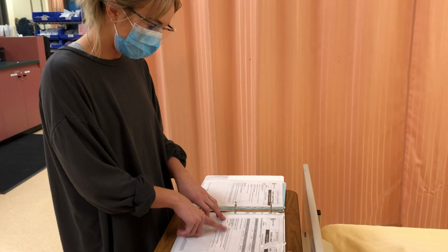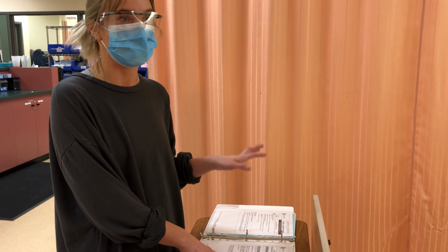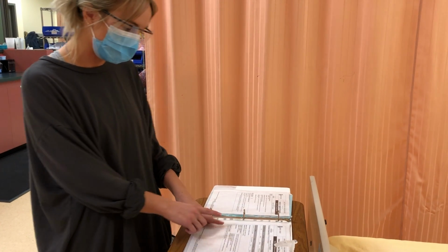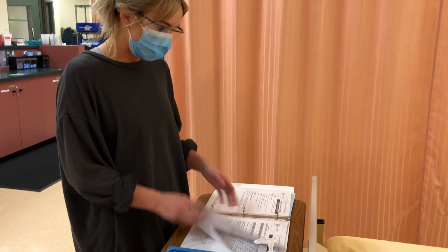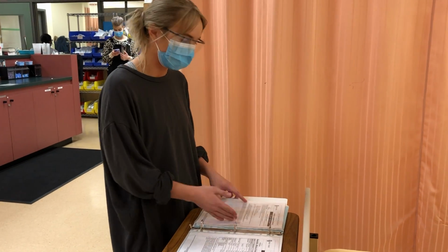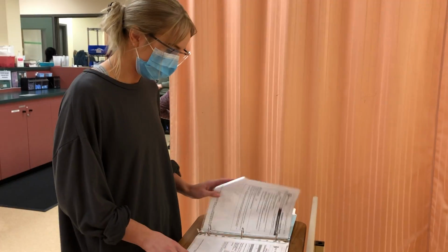For our stability and compatibility, it is compatible with normal saline, which is good because I know the patient has normal saline running TKO in their room, and we're going to be mixing it up with normal saline. Then some potential hazards: hypoglycemia, blurred vision, sweating, tremor, hunger, and some others that I'm going to be letting the patient know about. And then some additional notes on exactly how to draw it up, so that 1 ml in a 3 ml syringe. Okay, so that's all I really need from here.